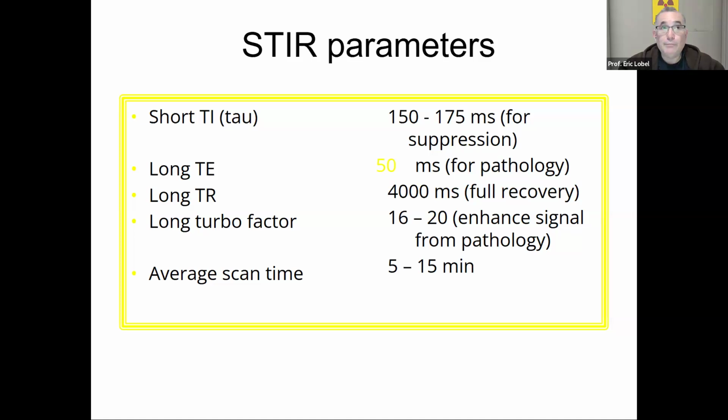Because what are the major things you can see on the scanner? Your TR, your TE, your TI, those times are there, right? And you can change them, but they're there. So when you're in the clinical environment, make note of what the TR, the TI, the TE, or any of the other times are when you are scanning, right? Take that extra second. Take a picture. Just don't get any important information.